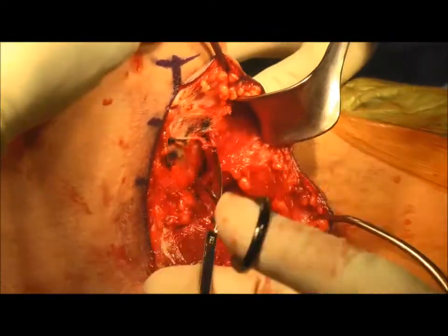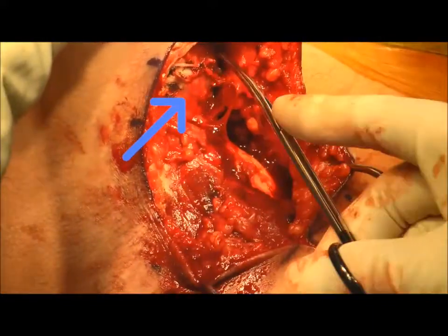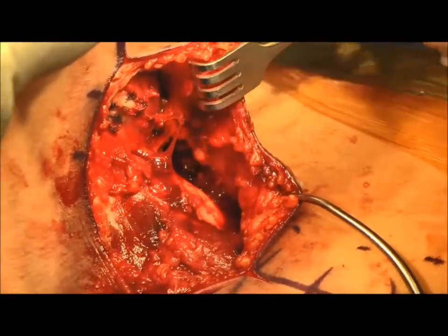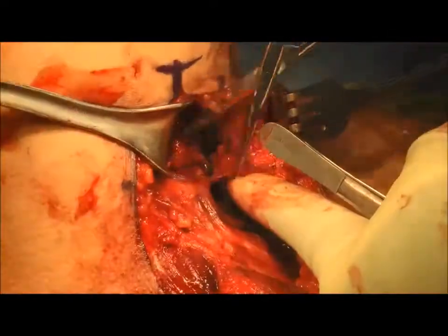Dissection continues towards the humerus. At this level, it is important to identify and preserve any branches of the posterior brachial cutaneous nerve, which is visualized here. A Richardson retractor is used to retract the triceps and the posterior brachial cutaneous nerve posteriorly.